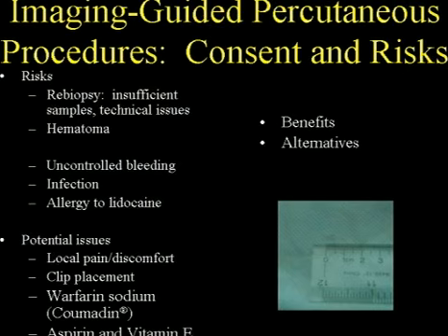This is the consent that I go over with the patient and the risks, and this is true for ultrasound-guided biopsies, but really all biopsies. Anything that's additional for each category I can add, but this is the general consent that I go over with the patient. So first of all, the risks, there are really not that many. The major risks really are that you need to discuss with the patient that there is a chance that they may need to be rebiopsied, that for different reasons such as insufficient samples or technical issues that they may have to undergo another type of biopsy.